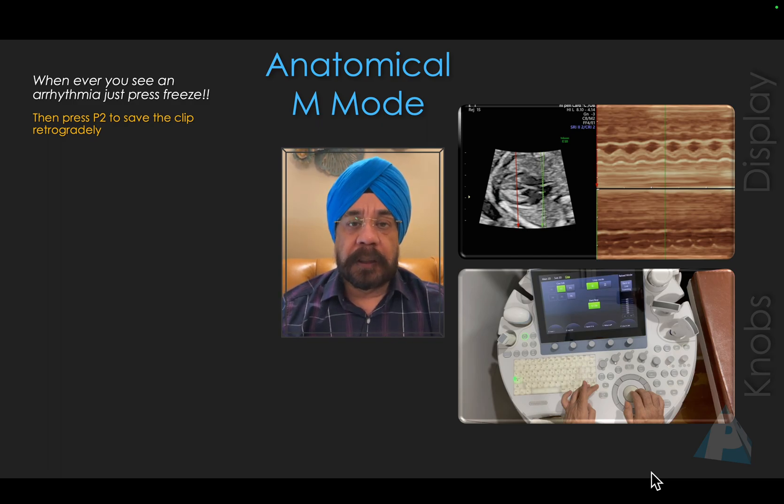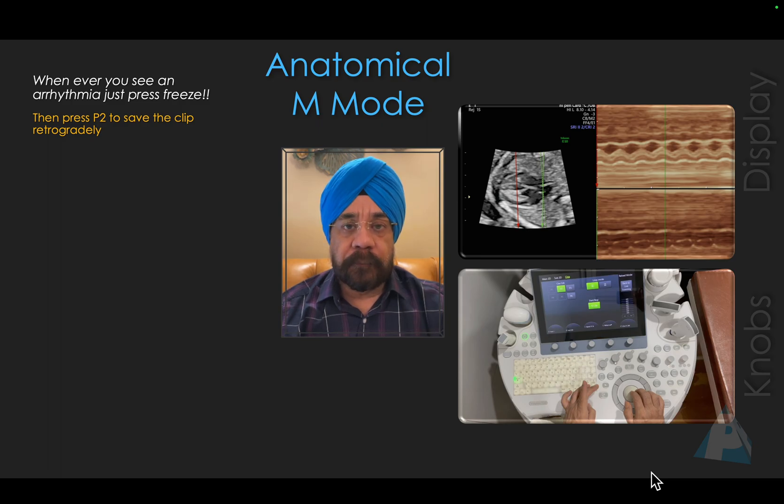Whenever you see arrhythmia, you are not on M-Mode — immediately freeze the image, then press P2 to save the clip retrospectively. Retrospective saving can be done once you freeze and press P2. It will save something like 12, 15, or 20 seconds depending on the machine settings you've configured.